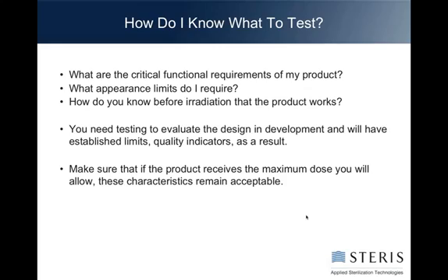Okay. How do I test this? Well, I always tell people start off with thinking about what critical functional requirements does my product have?